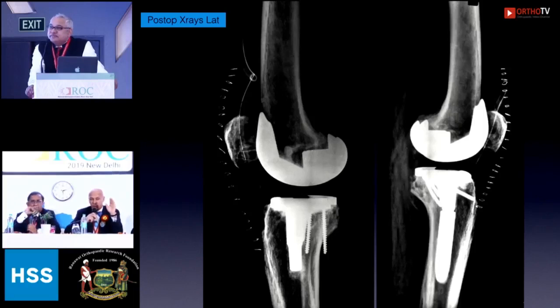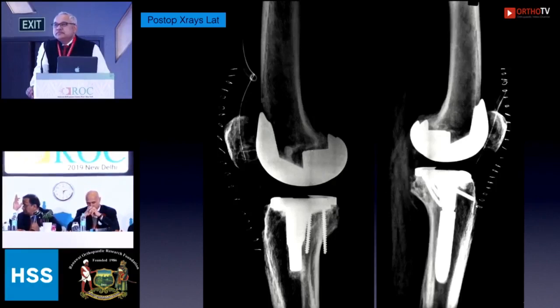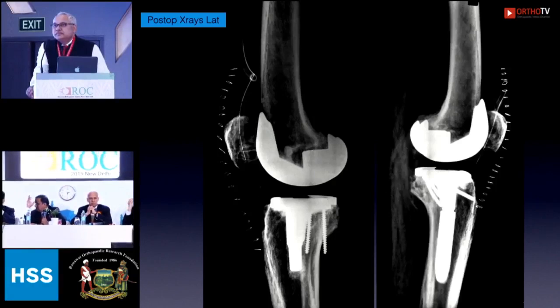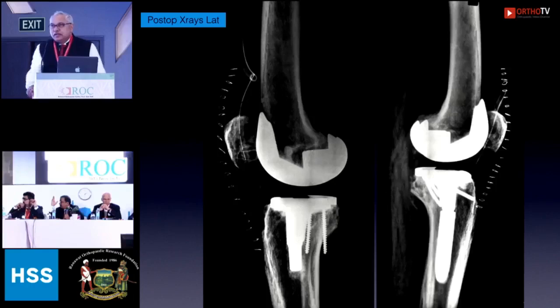So let's distinguish between the effect of the stem at mitigating angular forces and its effect on axial force with cement. Just because you have a stem that extends longer doesn't mean that you should not put cement to the same level that you would ordinarily put with a primary knee. You make a great point, Jose. There are people who just cement the undersurface of the tibial component. Then there are people who will just cement the undersurface and the metaphyseal sleeve and press-fit the stem. And then there's full cementation of the stem. I think if you're going to use graft and you're going to bypass, you should fully cement the stems in this case. Can I ask a question?